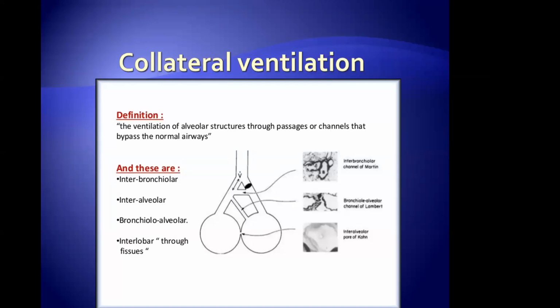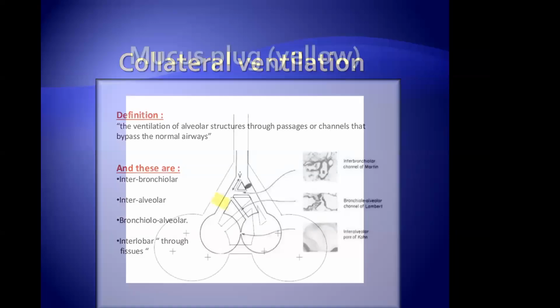Let me answer this. How did you learn to apply PEEP on a mechanical ventilator? I learned it: you go up on PEEP, up on PEEP, up on PEEP until cardiac output drops, then you go back to the previous setting. So as you're doing this, think about that. Go up on PEEP, up on PEEP, because I want to get where my patient is getting oxygenated and removing secretions.